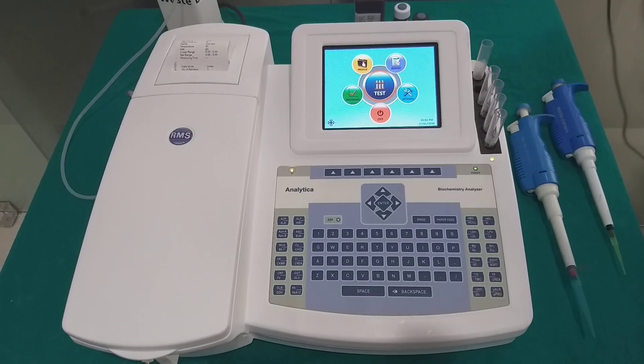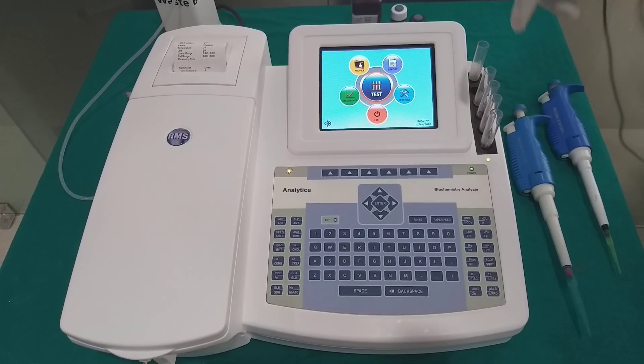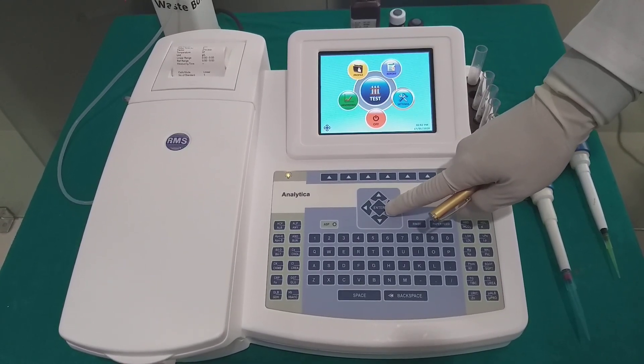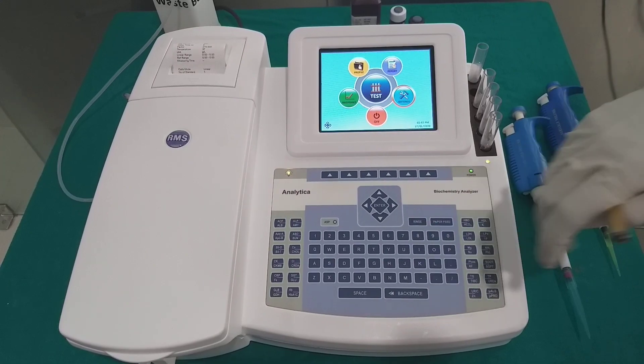Analytica gives an easy-to-use user interface with unparalleled convenience for ease of operations by using this menu of alphanumeric keypad.